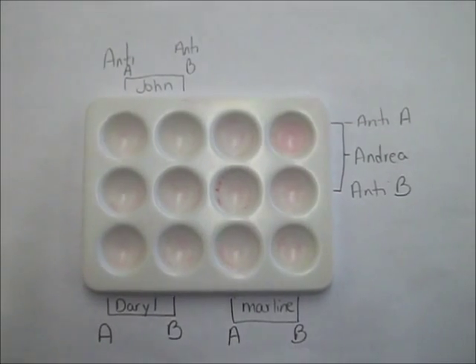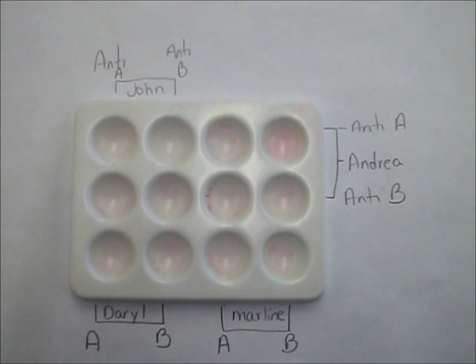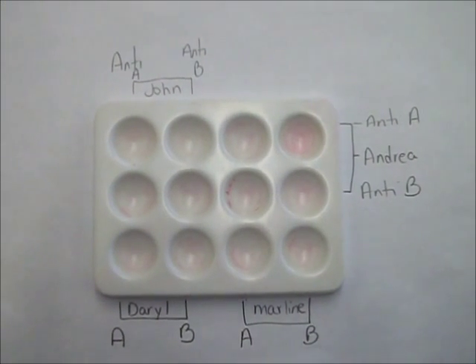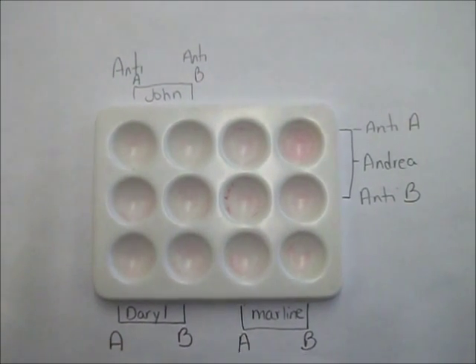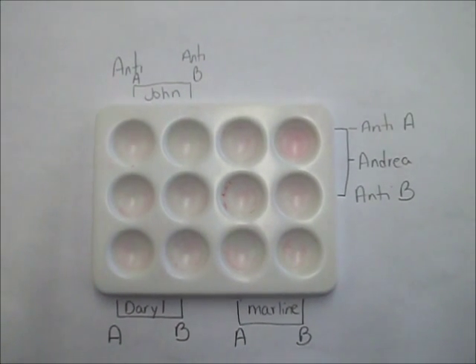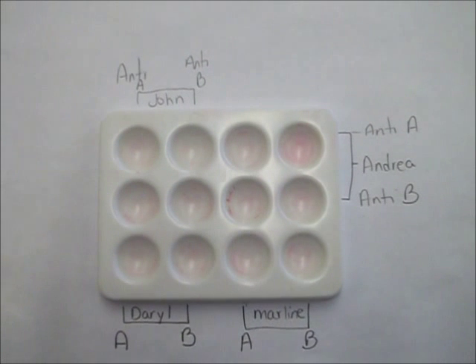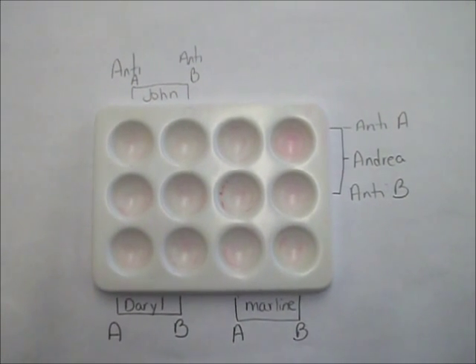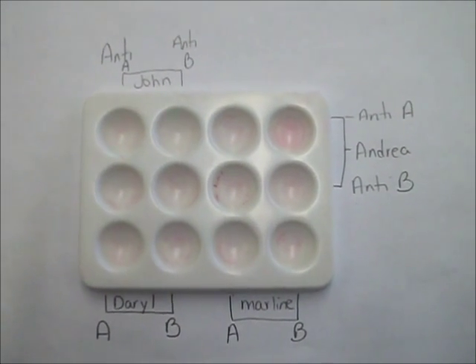We're now going to go into the lab and we're going to see how we figured out if Daryl is the son of Andrea and John. Now that we're in lab, the first thing we're going to do is set up the well plate to show each of the four people: John, Andrea, Daryl, and Marlene. I've indicated where I'm going to be adding anti-A and anti-B.